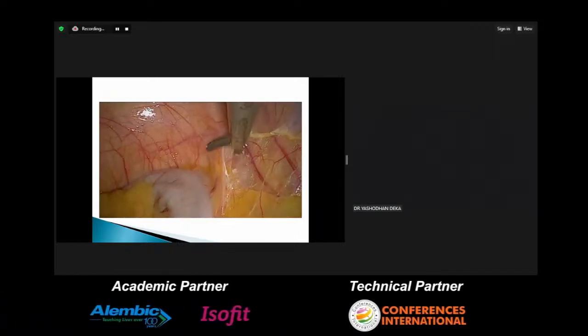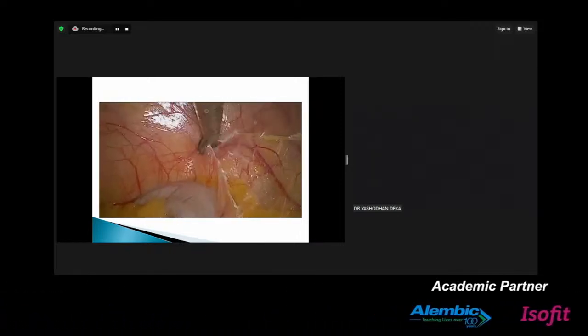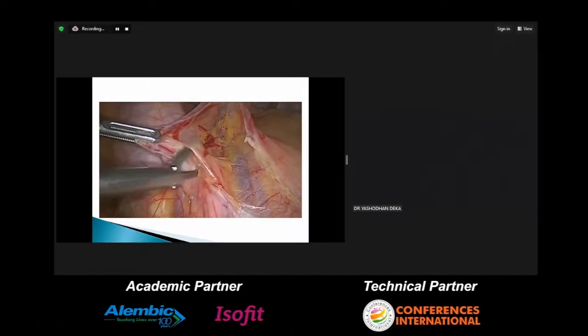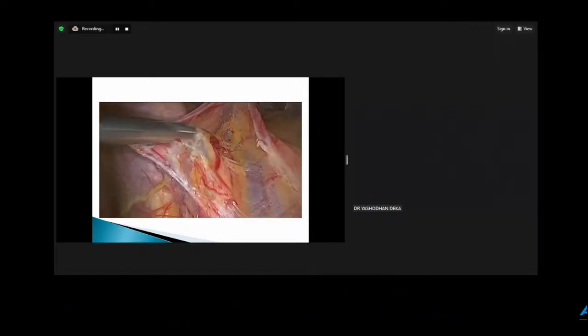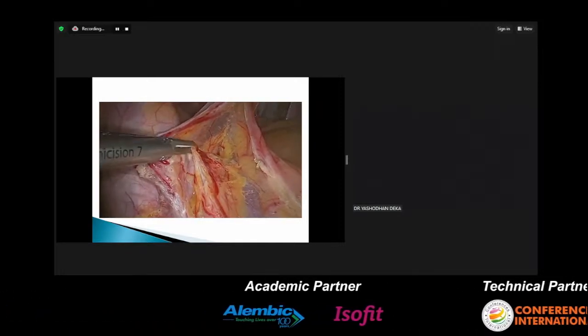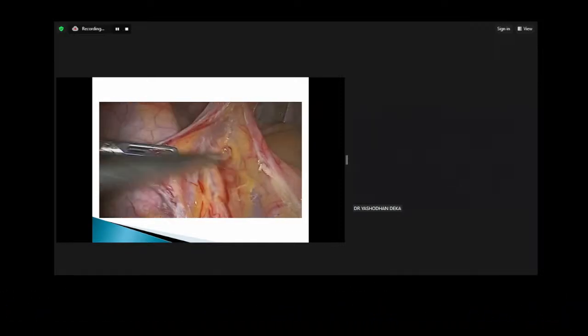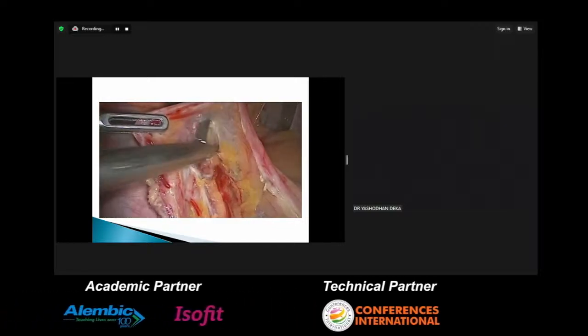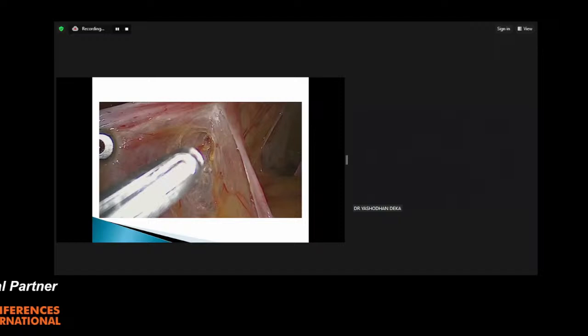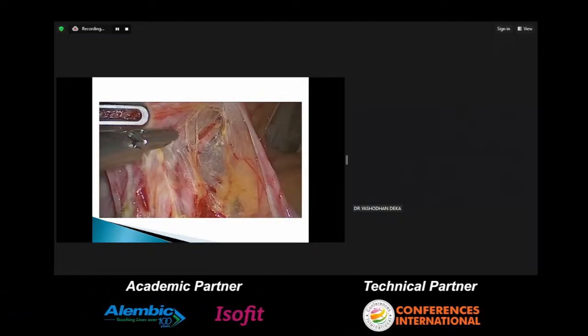The first thing you need to do is go laterally. So I call this the ultralateral approach, where you mobilize the sigmoid as laterally as possible, and then you just flip the sigmoid. Once you flip the sigmoid, the first structures that will appear in front of you are the infundibulopelvic ligament and the ureter right in front of you. So the ureters, of course, we have to safeguard, and we have to make sure they are lateralized from the lesion. These are very important safety measures.